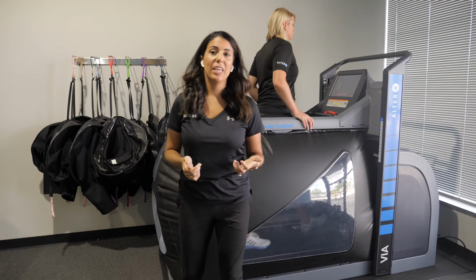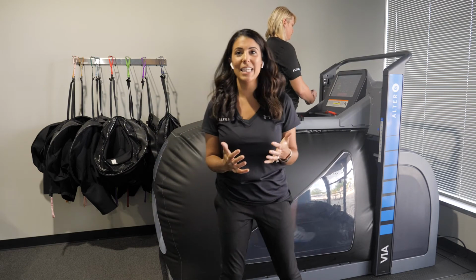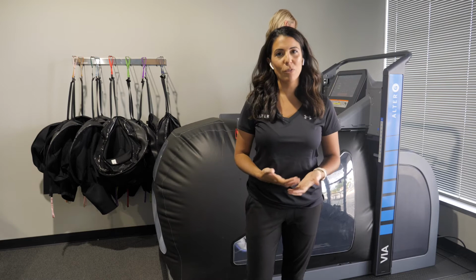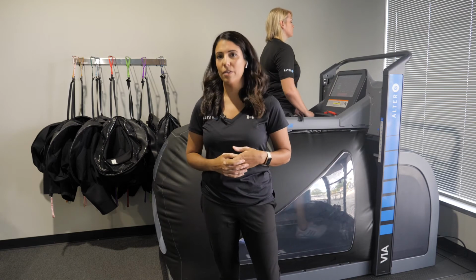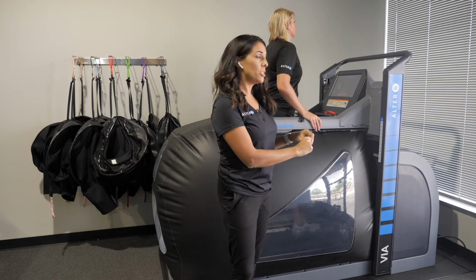The other benefit is that I can create the perfect practice condition for my patient. So I always get asked, what's the right amount of body weight that I should have my patient walk at? And there's really no right answer for that. For every patient, for every goal that you're using the treadmill for, the amount of body weight is going to vary. But now I can see that direct effect of body weight on my patient's symmetry.